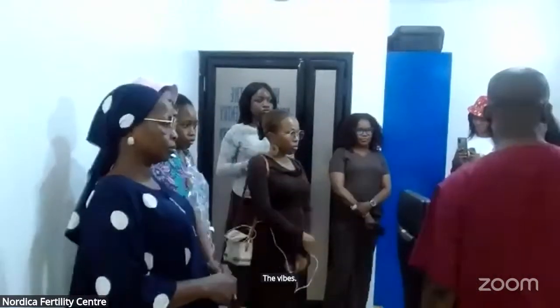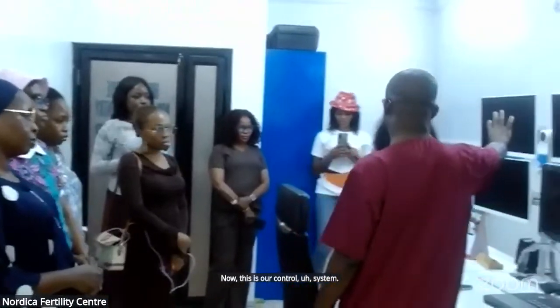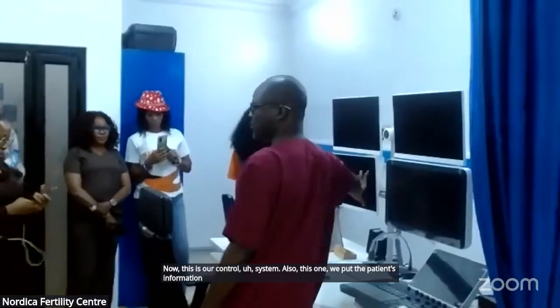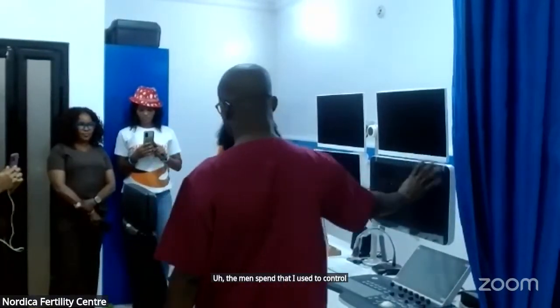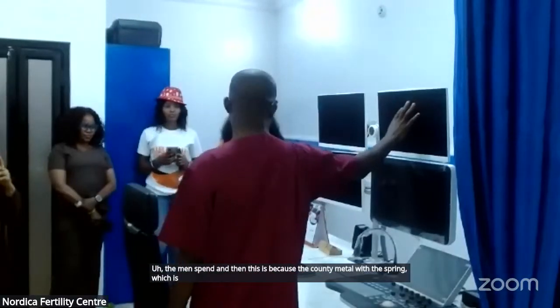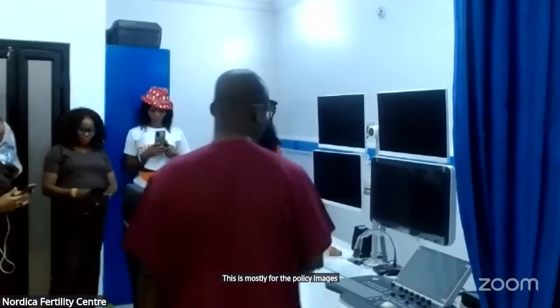Now, this is our control system. Also, in this one, we put the patient's information there. This is the main screen that I use to control the machine. And then this is just the complementary screen. You display the MRI there. This is just to support the images that we are getting from here.